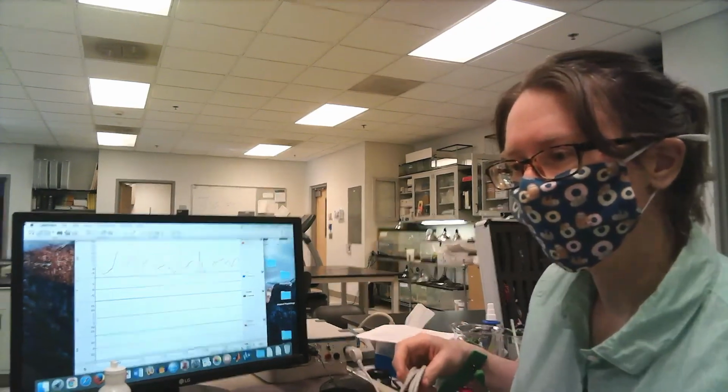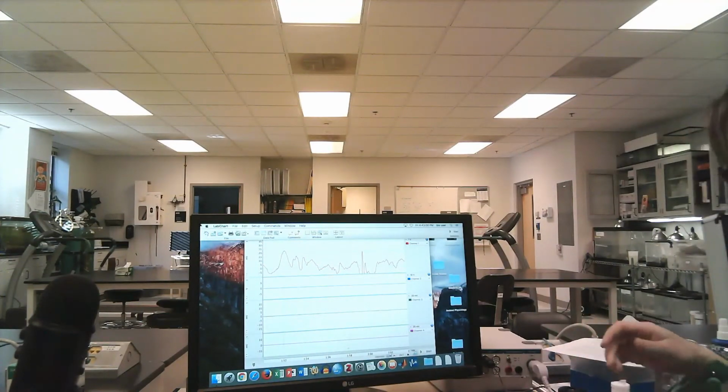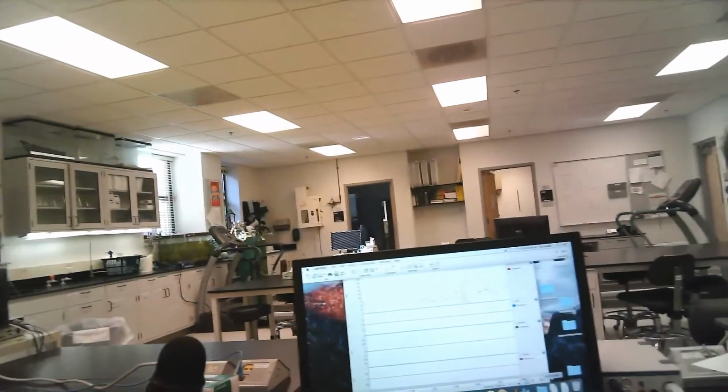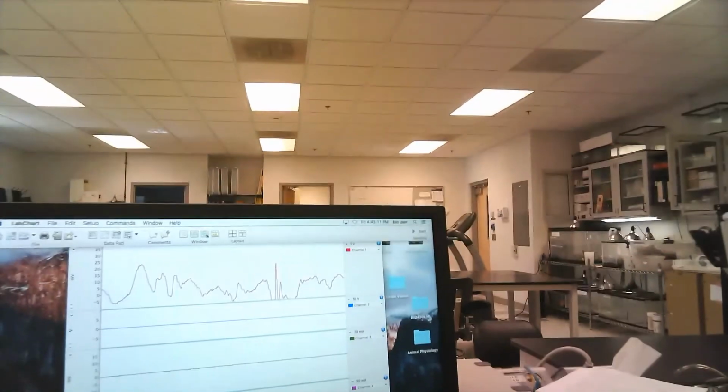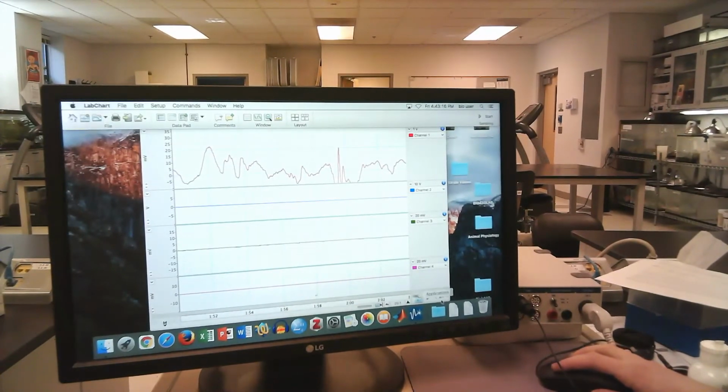So now, all right, I'm all wired up. I'm going to press start. Got tons of wires going here. Let me bring you in a little closer. Okay. I'm going to press start.